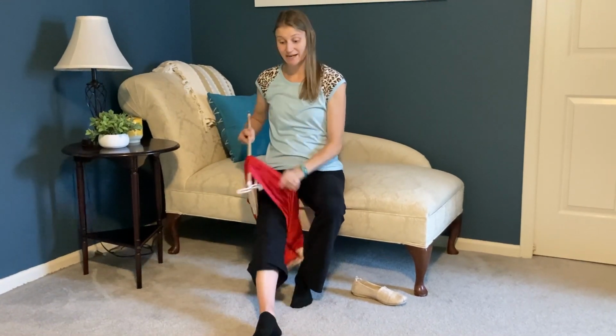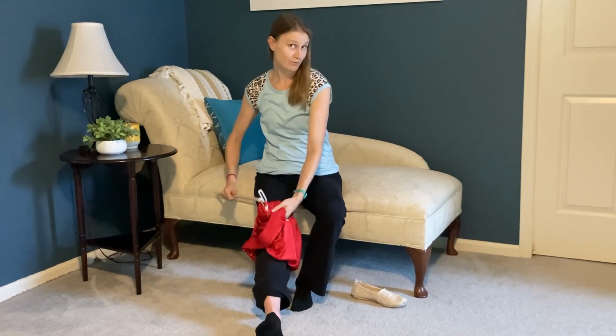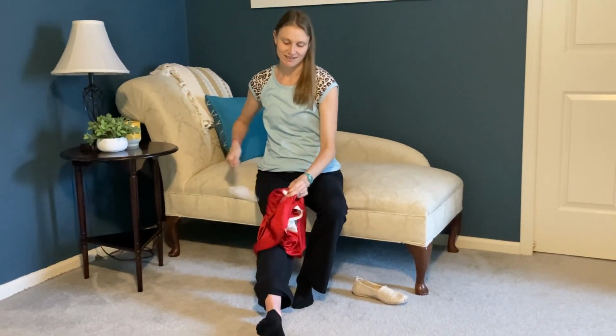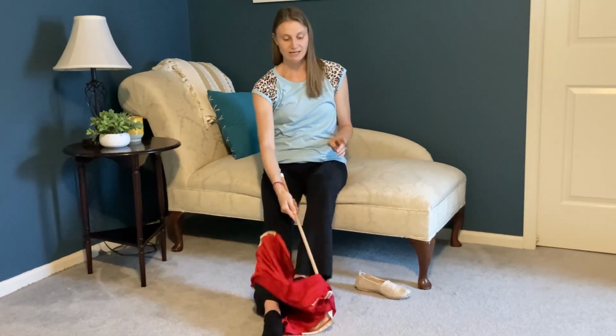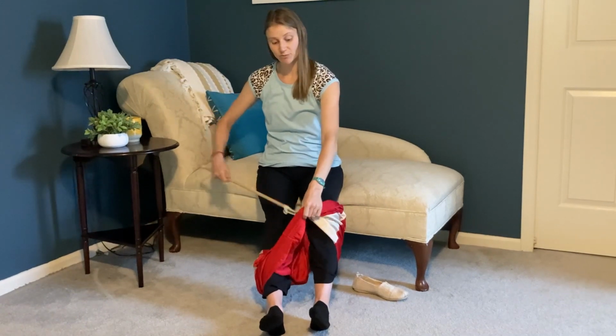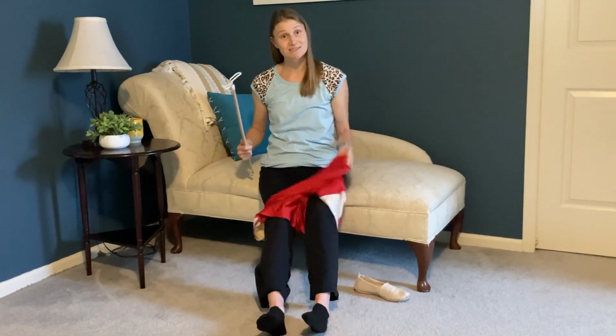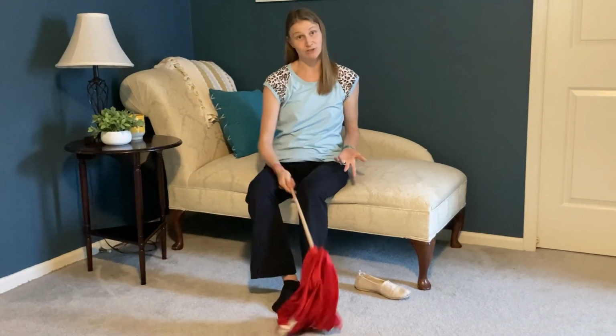and I can use that to lower down, get my pants up to where I can reach them, fish this out, maybe, get that unstuck, find the other leg, reach that down to the level where I can reach it, fish my foot in, and I can effectively use this for both putting on the pants and then getting the pants back off when you're done. I can use that to kind of push those off.